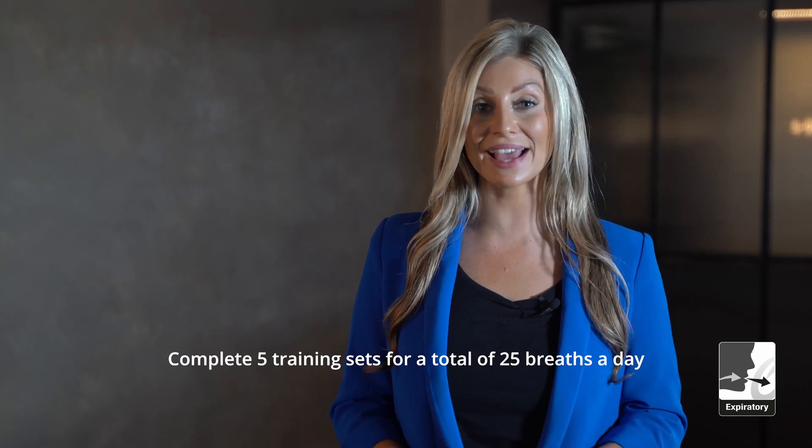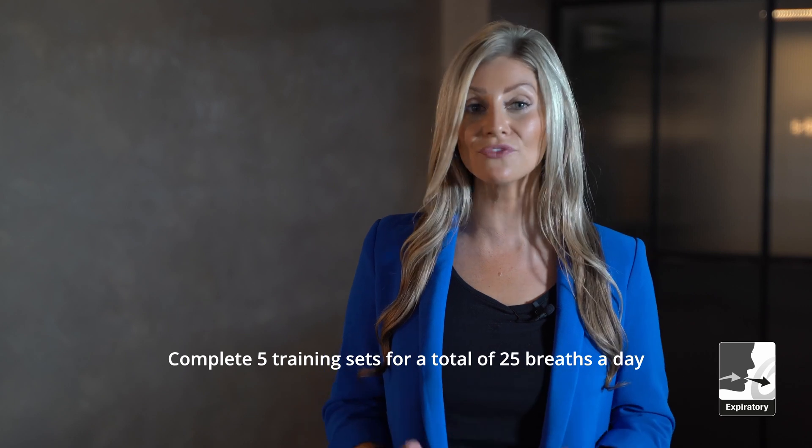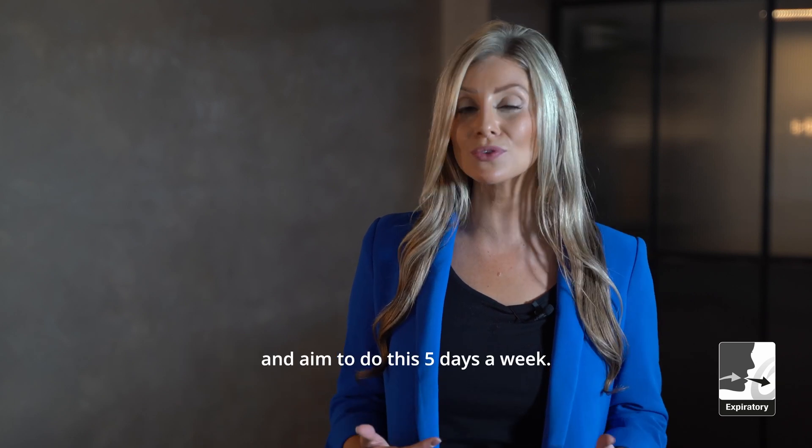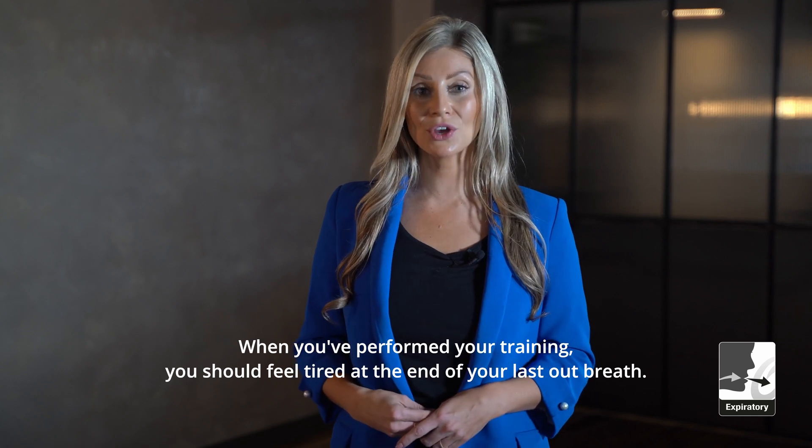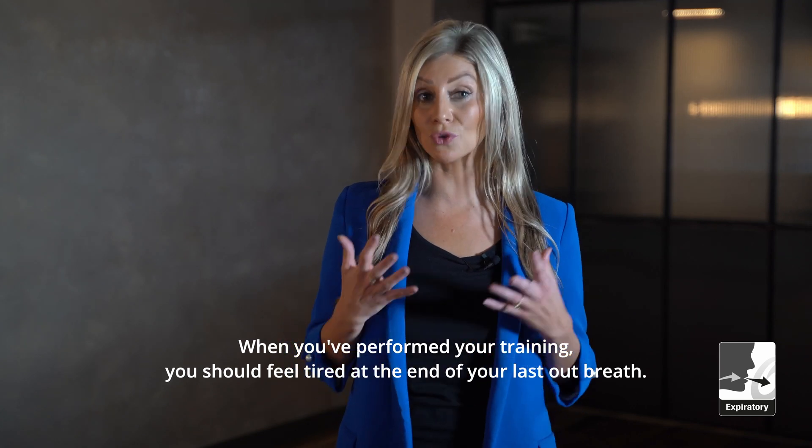Complete five training sets for a total of 25 breaths a day and aim to do this five days a week. When you've performed your training, you should feel tired at the end of your last breath.